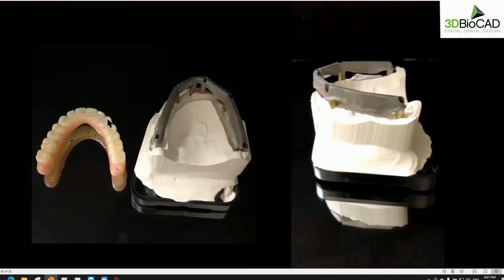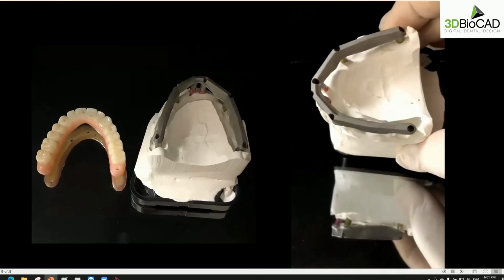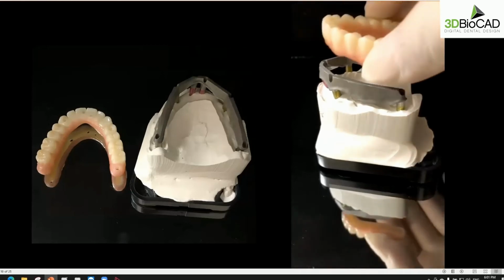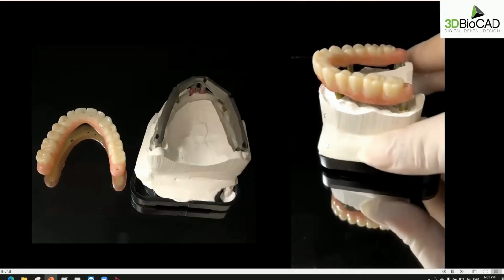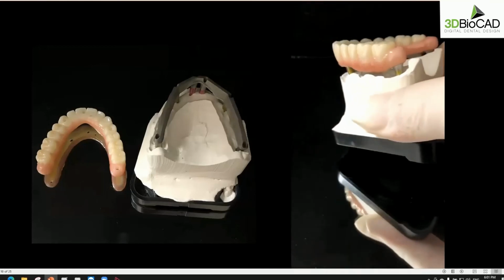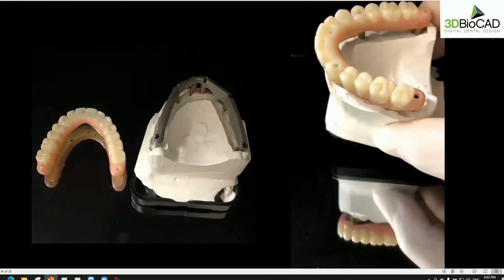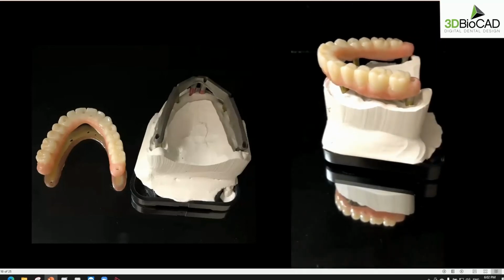And this bar, I already sandblasted the titanium. That's why it's colored like that. So after milling the bar, we make a zirconia bridge on top of it, and then we do the cementing on the laboratory side. All right. So once it's cemented, on the clinic side, chairside, you just need to screw it down at delivery. Then it's just the same as any other screw-retained bridge.